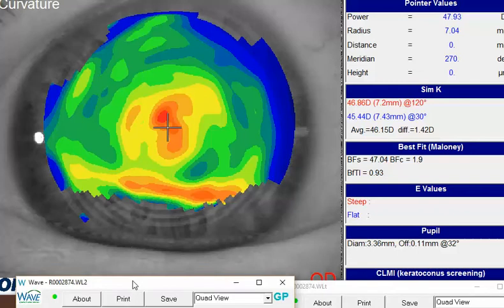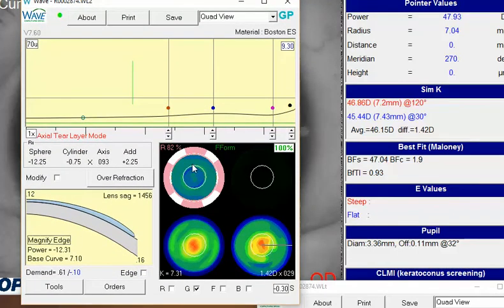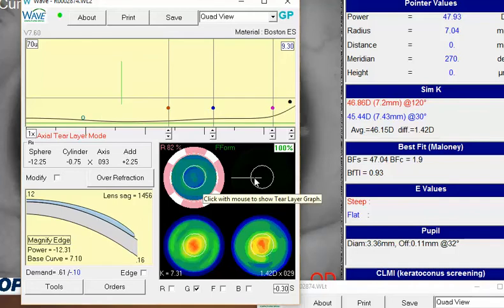With that said, if we look at your design, it's a nice looking design based on the Wave software. It looks like an appropriate fit. However, as you know, it's not fitting optimally. So a couple thoughts. Since the lens is riding high, it sounds like it's fitting kind of steep. You obviously want to flatten it up. And what I like to do in those cases is recommend that we try to get this landing zone between the blue and the pink dot aligned as nicely as we can.